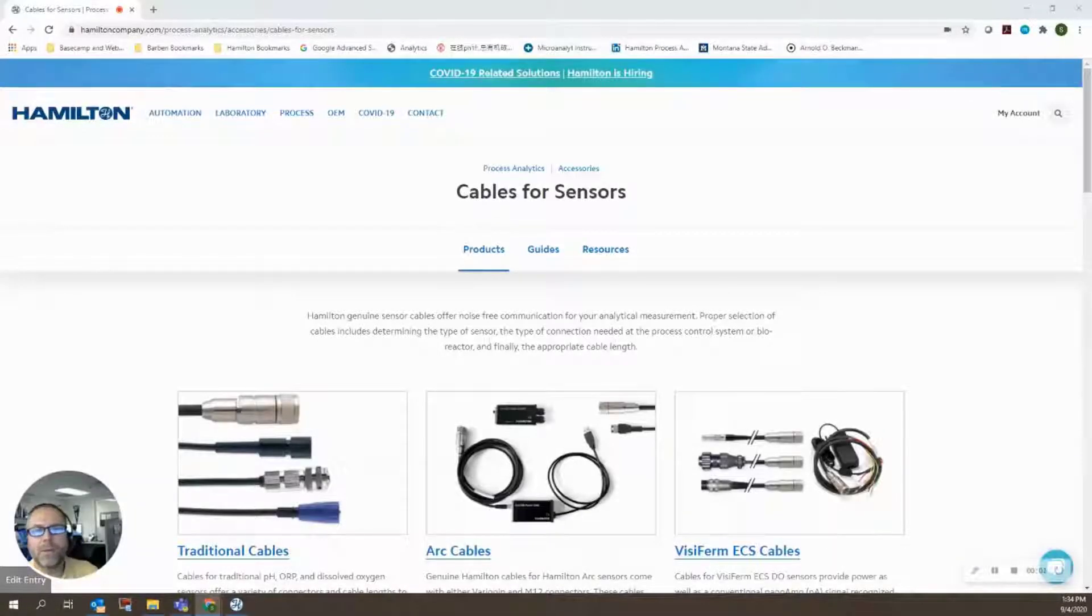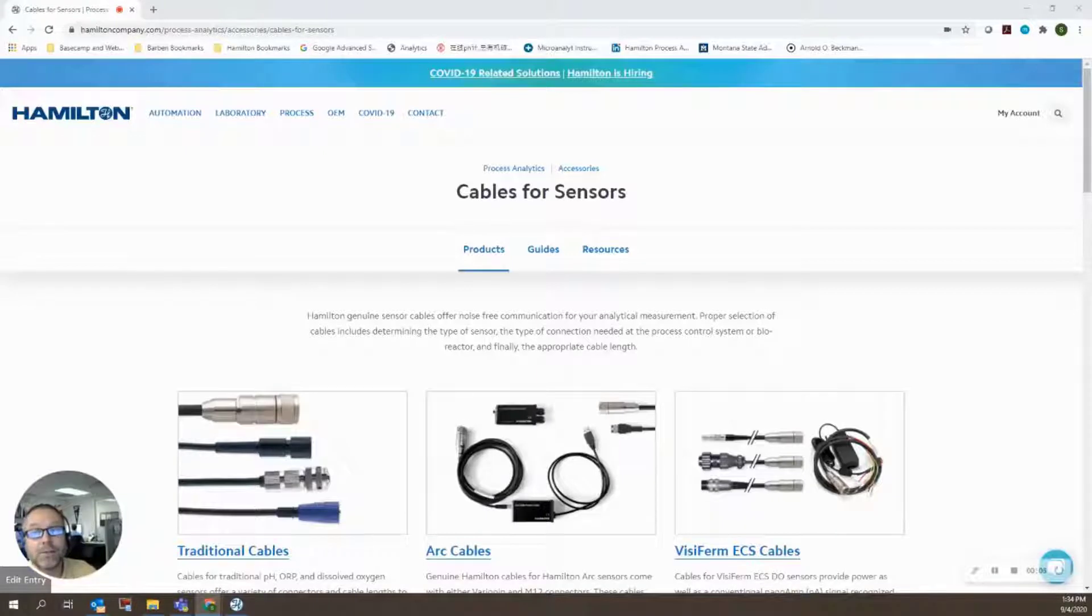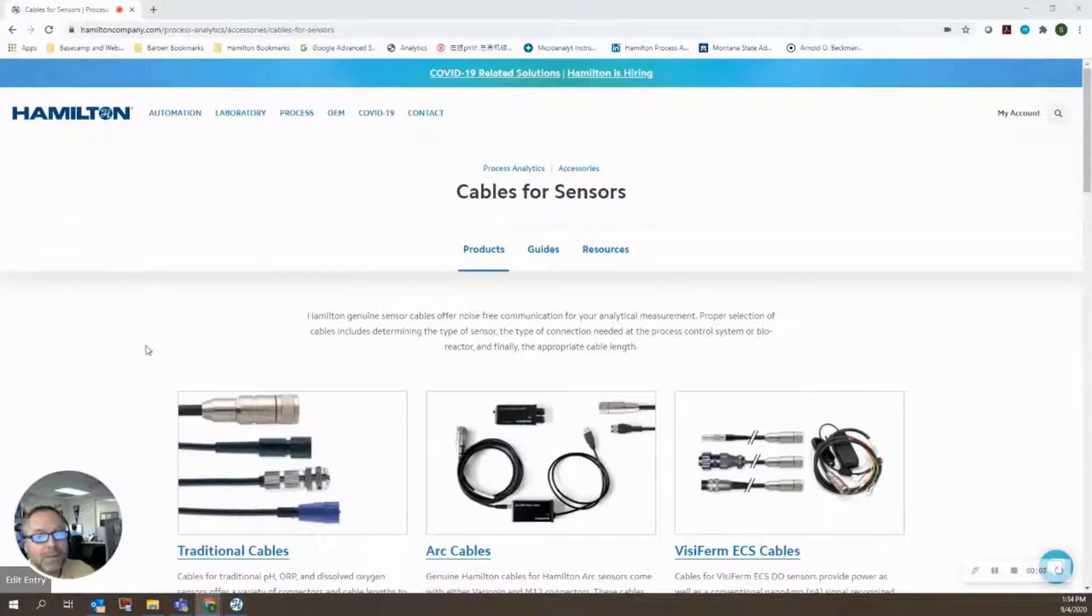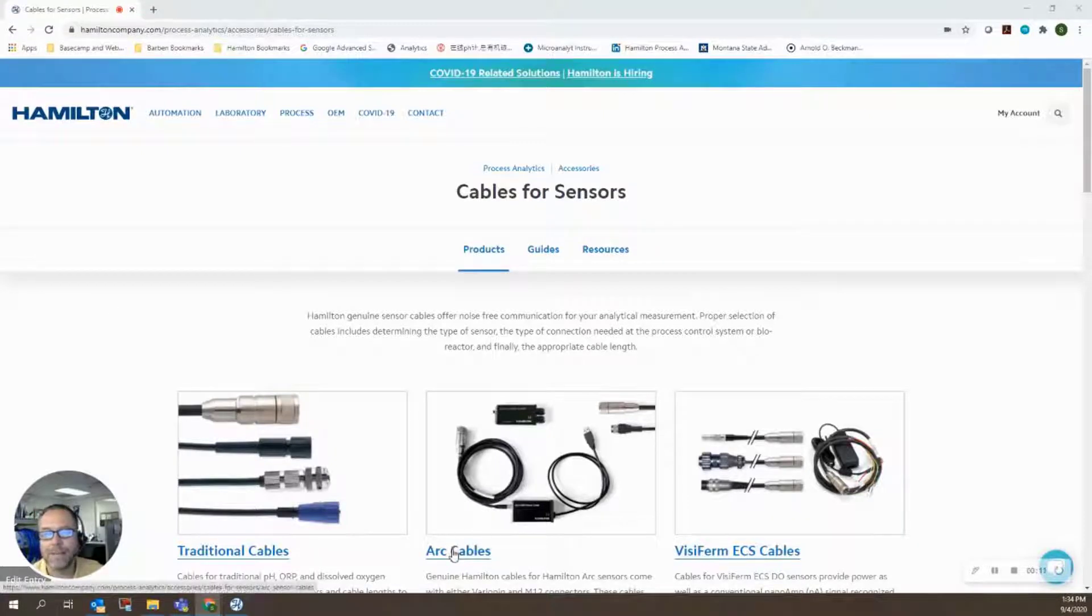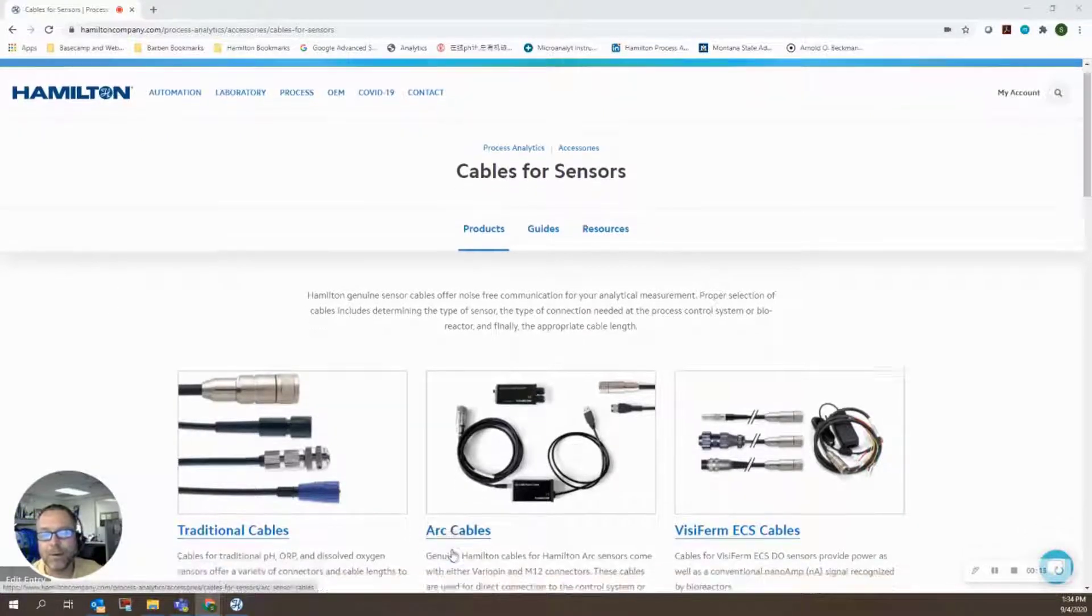Okay, in this video we're going to take a look at doing firmware updates on ARC sensors. So to do a firmware update, the first thing is that you need a cable that will allow you to connect the sensor to a computer running ARC Air.